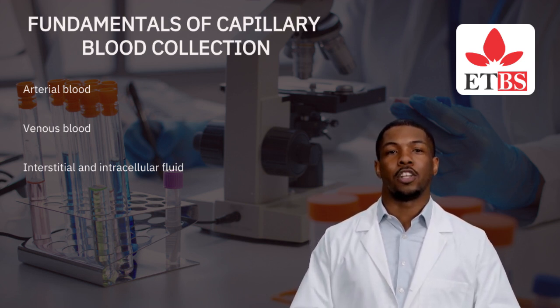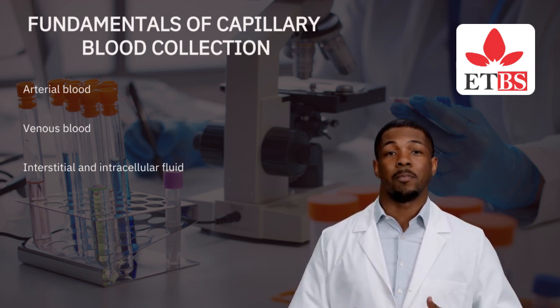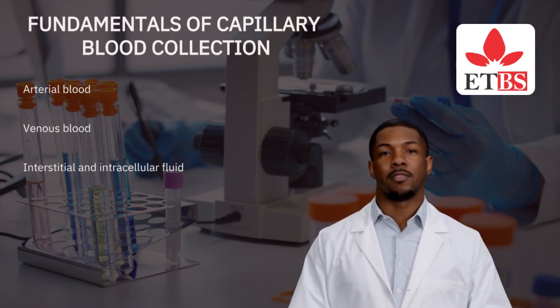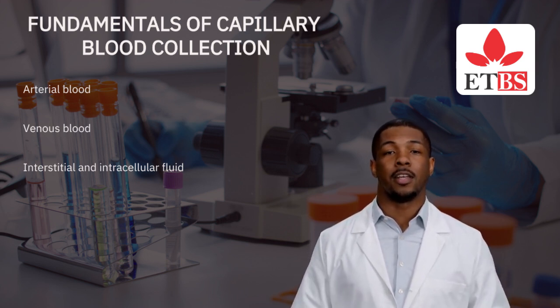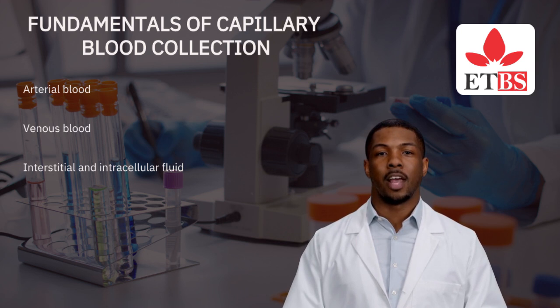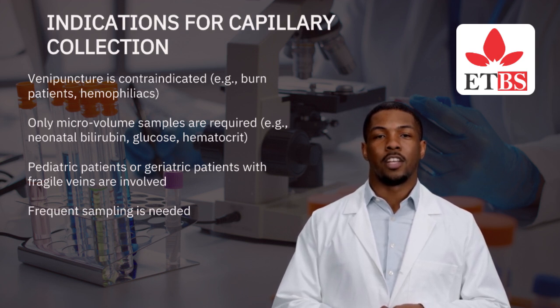7.1 Fundamentals of capillary blood collection. Capillary blood is a mixture of arterial blood, venous blood, interstitial and intracellular fluid. It is commonly used when only small amounts of blood are required, venous access is difficult, or minimally invasive methods are needed, e.g. infants, elderly. Key advantages: minimally invasive, less pain and trauma. Quick recovery, no venous collapse risk. Ideal for point-of-care testing, e.g. glucometers.